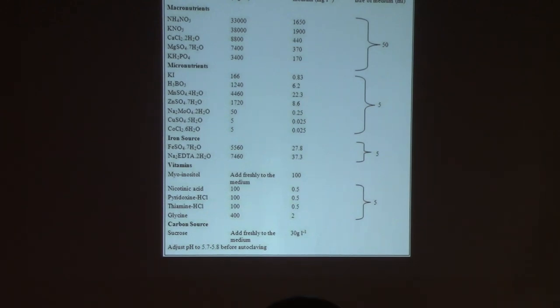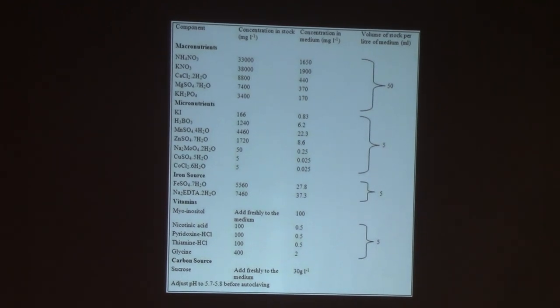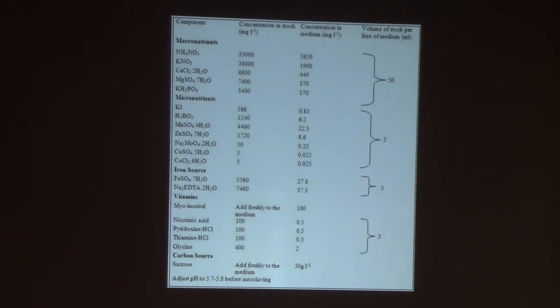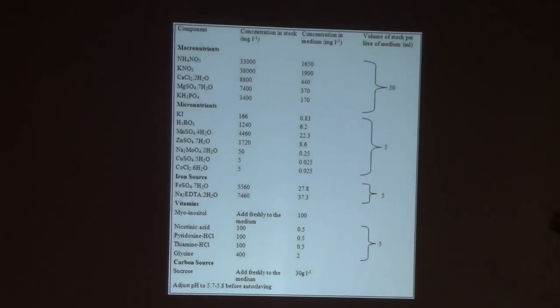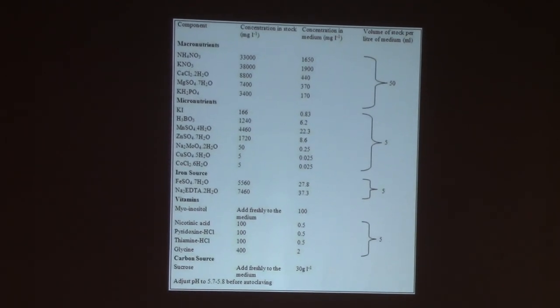All life needs B complexes, all life needs carbon sources and nitrogen sources. So you can see this in E. coli media, you can see this in like Eagle media, aside from all those other crazy expensive cofactors that you guys put in. So basically this is the... It was made in 1962, and it is the most important formula for plants today.